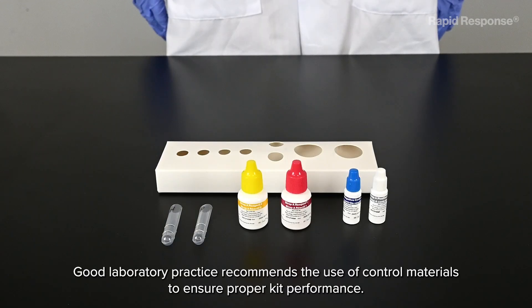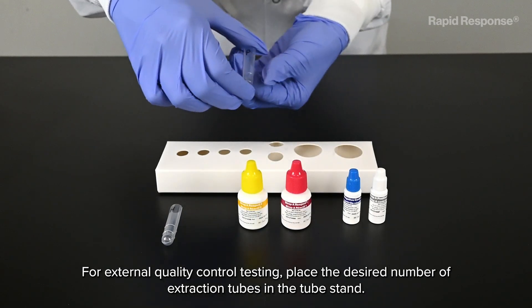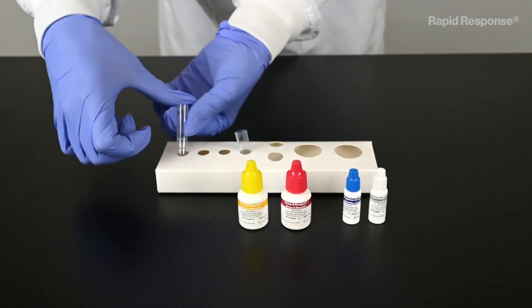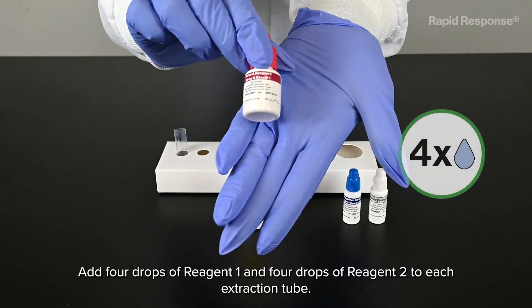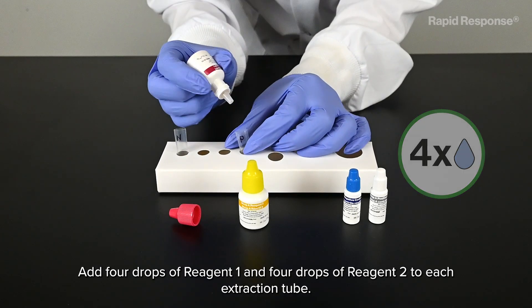Good laboratory practice recommends the use of control materials to ensure proper kit performance. For external quality control testing, place the desired number of extraction tubes in the tube stand. Add four drops of reagent 1 and four drops of reagent 2 to each extraction tube.